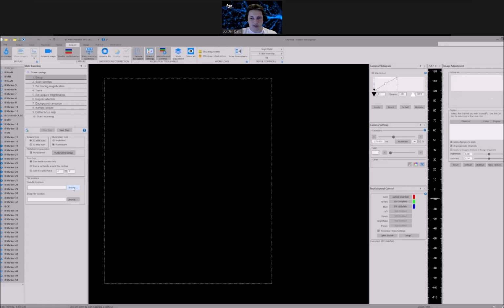In the first setup step, we need to define the base settings of our scan. For this demo, I'm going to set the Acquire type to be a 2D slide scan and have my illumination type set to fluorescent. I can also take a single channel or multi-channel fluorescent slide scan. Today I'm going to demonstrate taking multi-channel scans, so I'm going to leave that box checked.